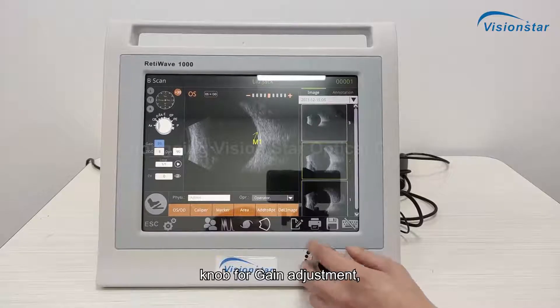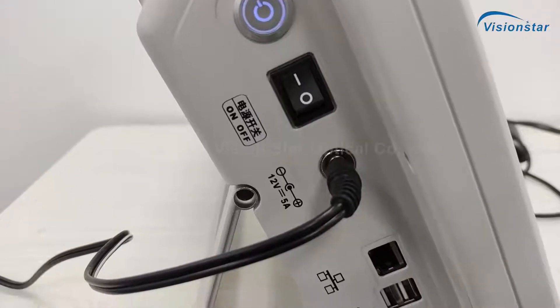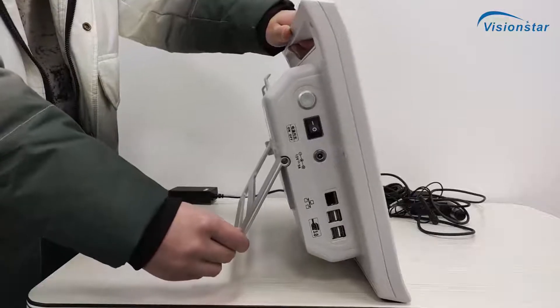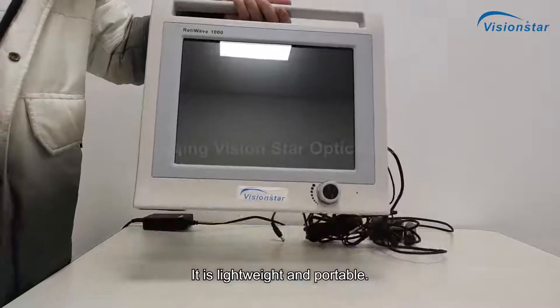The device features a knob for gain adjustment, Internet and USB ports, and a foldable support bracket. It is lightweight and portable.